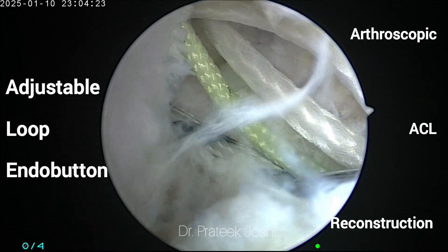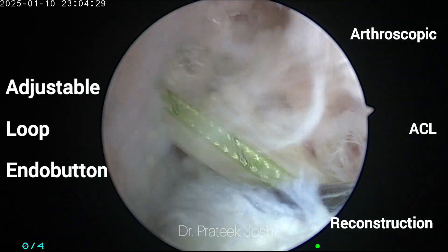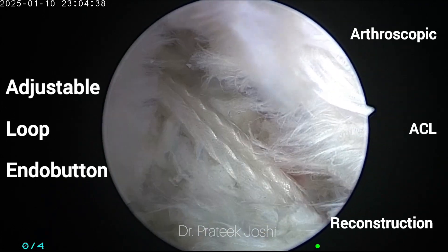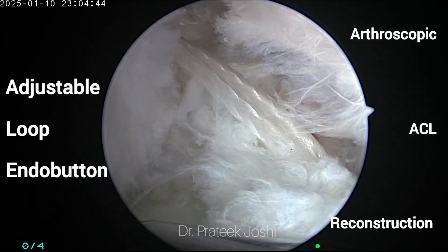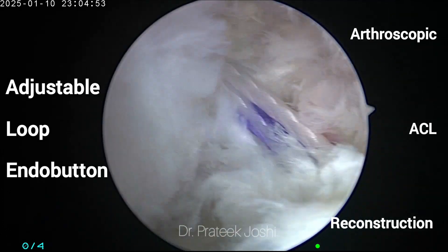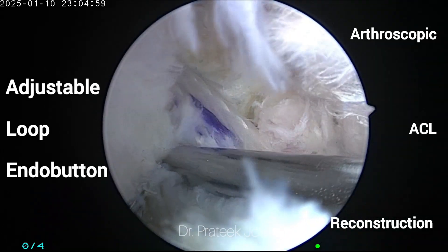So now you are seeing the picture of the inside of the knee from the anterolateral portal. You can see that I am shuttling the adjustable loop endo button from the tibial tunnel to the femoral tunnel. You can see that the endo button is going through the femoral tunnel. We will stop at the mark which we had made on the adjustable loop with the marker pen, which corresponds to 35 millimeters — the length of our femoral tunnel.